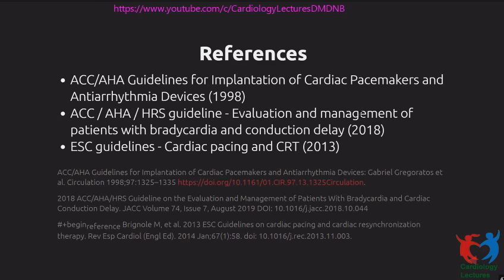The interesting question that people are trying to answer now is whether to directly pace all these patients in the His bundle region. I would say at present, we should not do that, but long-term, that is something that might change.